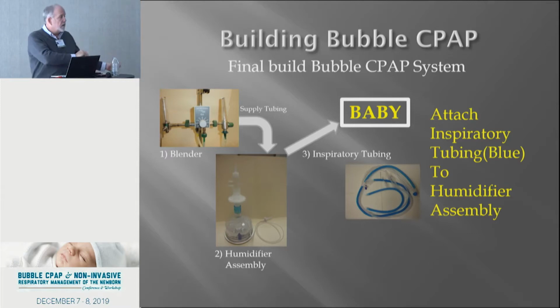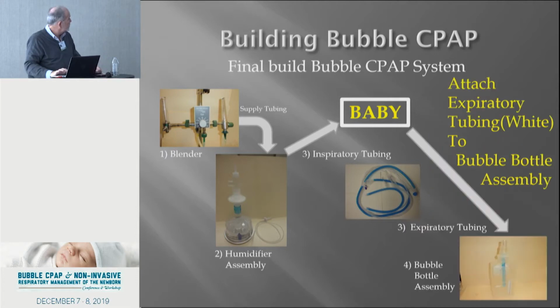as opposed to if you were using a machine, they're having to go through, most likely, depending on what kind of machine you're using, 3 feet of tubing or some kind of flow change and some reading to get the readings that you want, get it triggered. But with this, it's simple, it's straightforward. The baby breathes in, the flow goes this way. Baby exhales, the flow continues across the top of the cannula. Goes from there to the bubble. If you put this expiratory limb under 5 centimeters of water, you have to push 5 centimeters of water for it to come out.